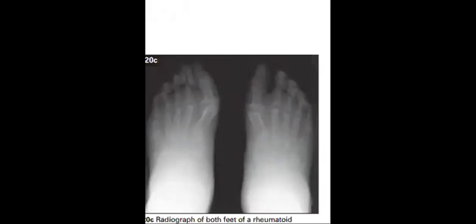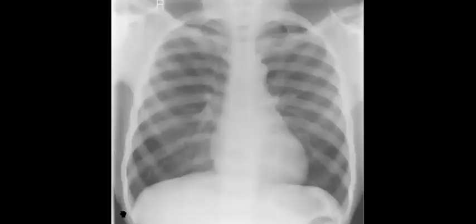I see that everyone is going well with this. Maybe we can shift to another case now. I hope that you like it. So, let's go with this one.